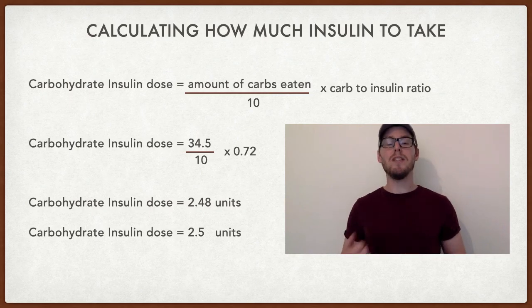Now because my insulin pen only goes up in 0.5 units, I had to round that up to 2.5 units of insulin.